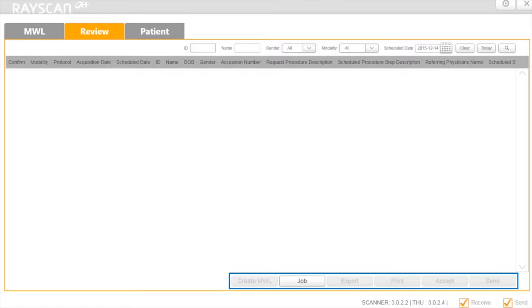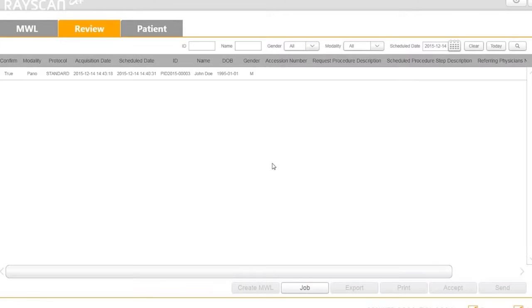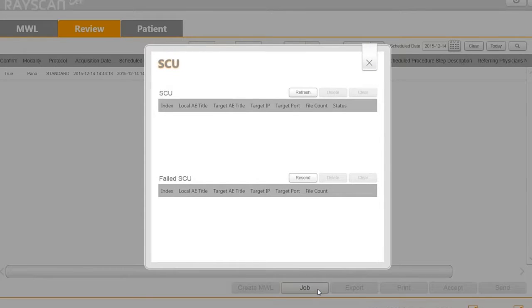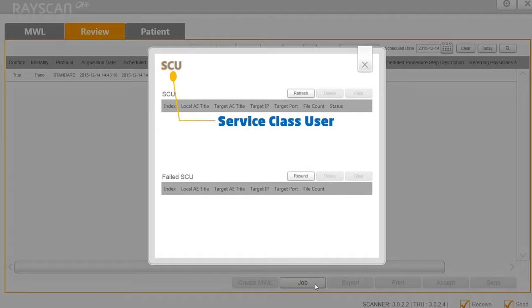In the Review tab, you can access the acquired image with Preview. By clicking on the Job button, it will open the SCU window.